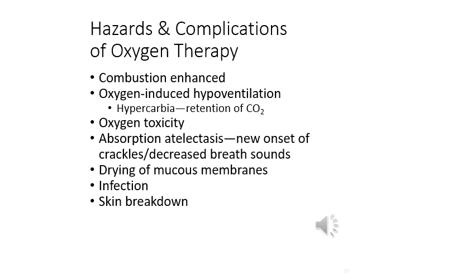Drying of the mucous membranes. If you have an O2 level greater than 4 liters, or if it's on continuous, you want to avoid mucous membranes from getting irritated or breaking down. So you want to be humidifying that air, adding that sterile water bottle onto your oxygen. And then you want to be monitoring for infection. So you want to really be monitoring that equipment.